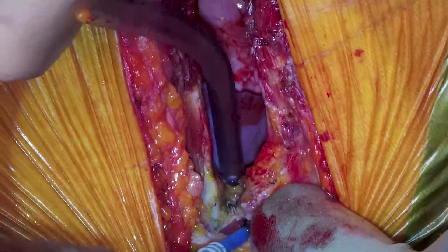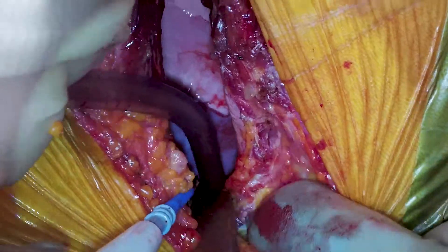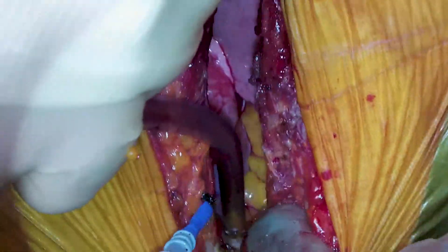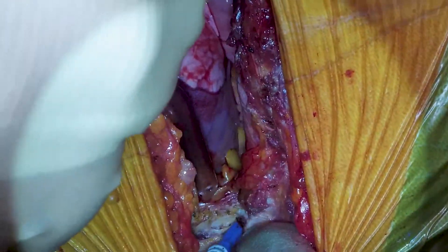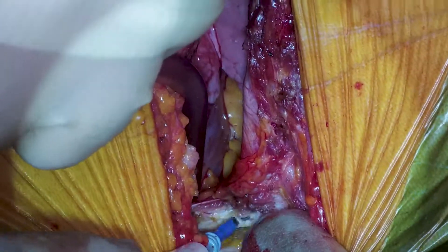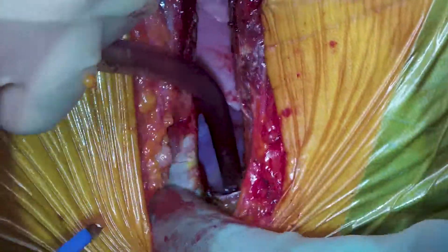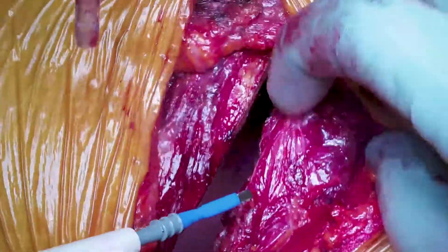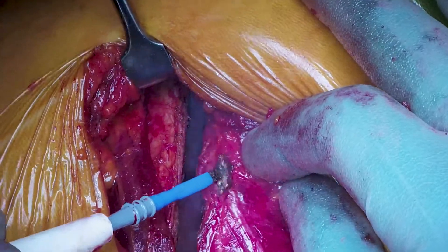A bit of context for this case: on this lady's CT scan — from a different hospital, which is why I couldn't include the images — it looked like she had a strong level of adhesion to the chest wall. The case was initially planned to be done robotically, but there was uncertainty about whether the high level of adhesions would make robotic entry too difficult. In the second part of the video, you'll see that Mr. Dunning was quite upset that the robot couldn't be used.